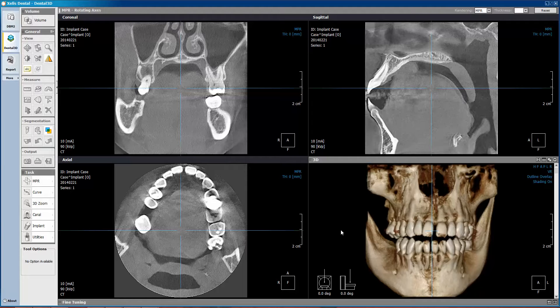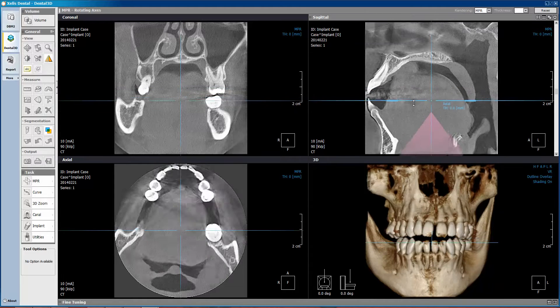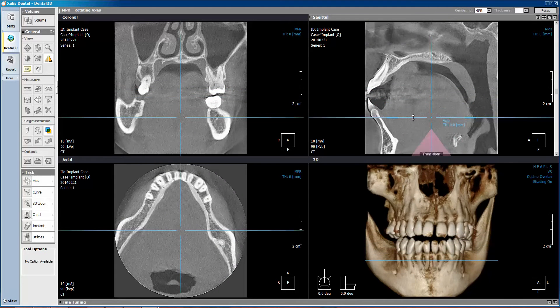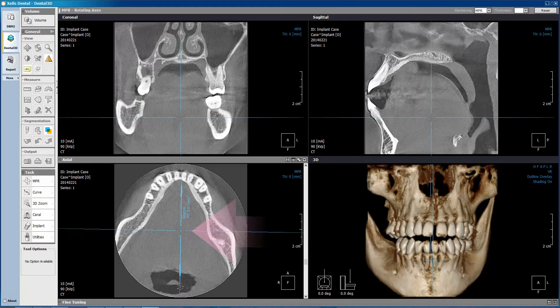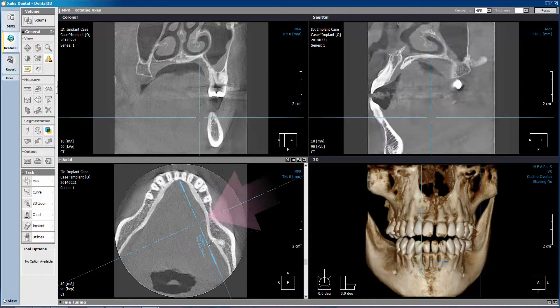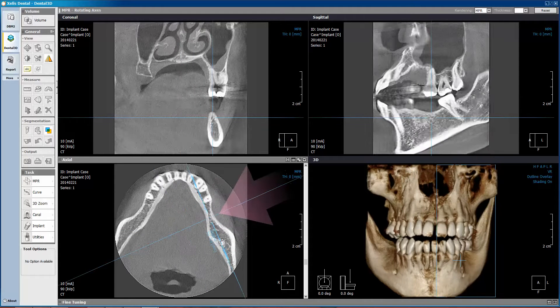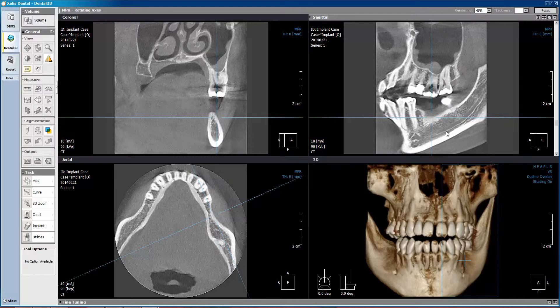How to trace the mandibular nerve canal in Xelis 3D software. We will begin by moving the axial view inferior so that we get a clear view of the patient's mandible. Then move the vertical line, which shows the location of the sagittal view in the top right corner, and slide it over to where we can see the mandibular nerve canal in the sagittal view.